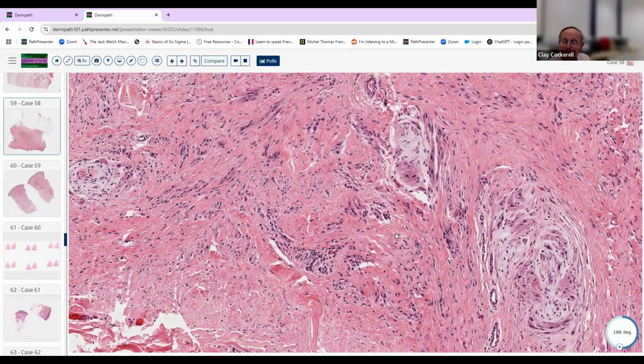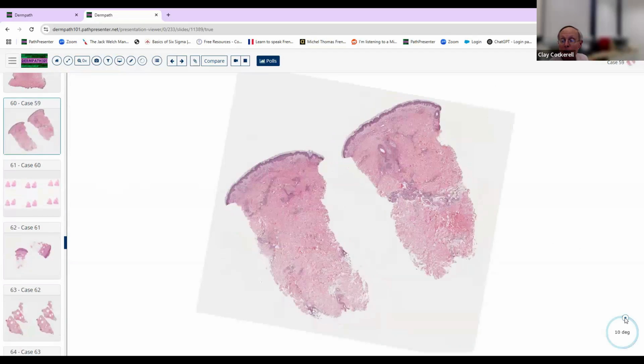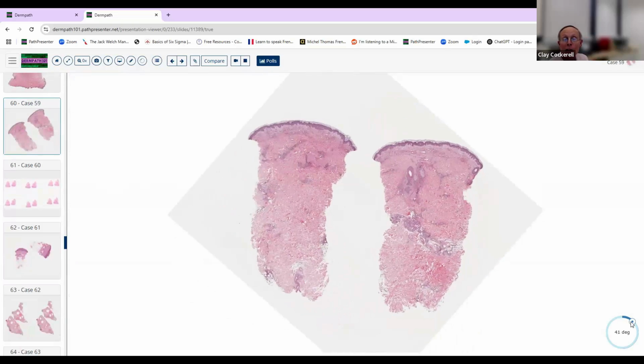Traumatic neuroma. The most common place we see this is in an amputated accessory digit. That's where we classically see traumatic neuromas, not any of these other entities. It's not a neurofibroma, not a schwannoma. These are nerves. It's not a perineurioma where you have a nerve surrounding these whorls of these spindle-shaped cells here. These are irregular nerve twigs that are formed by their undergoing this degeneration, Wallerian degeneration.